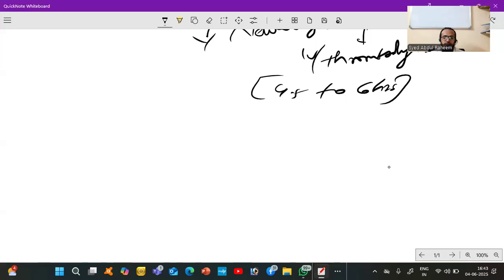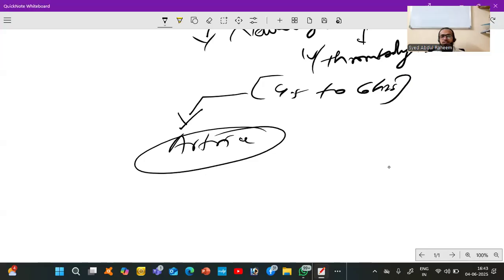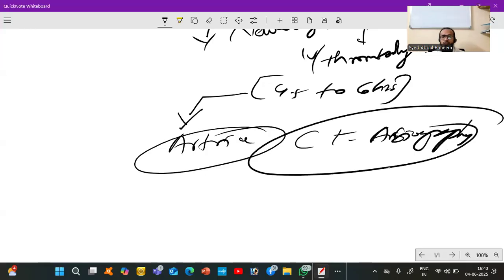But after the window period, one thing they will do is rule out which artery is blocked. That's the reason they will advise CT and CT angiography. In that you will see the occlusion, where the artery blockade happened.